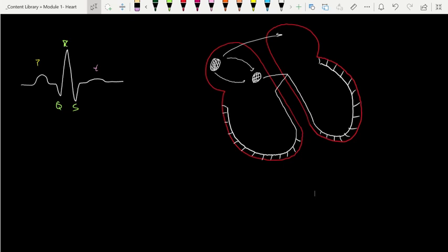All right, we previously described what the P wave looks like. Let's look at it now in the context of the whole story. Let's apply our simple two-lead system, where we're going to put our negative lead here and our positive lead here.